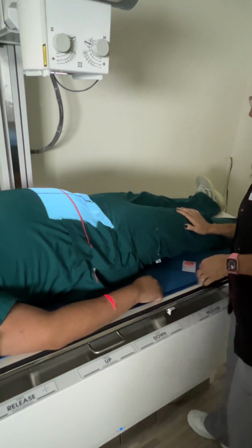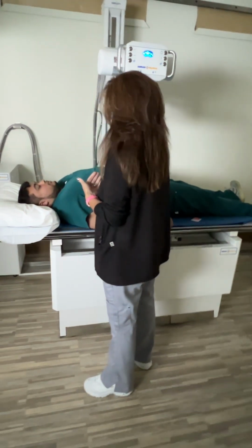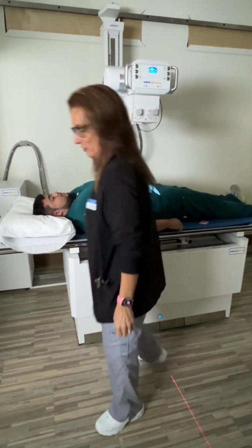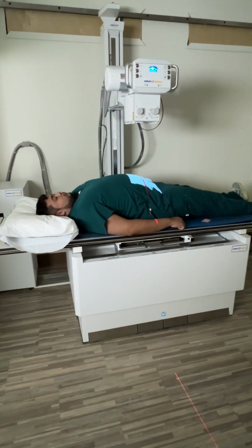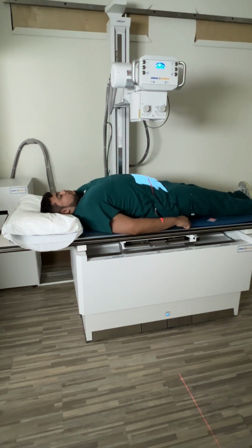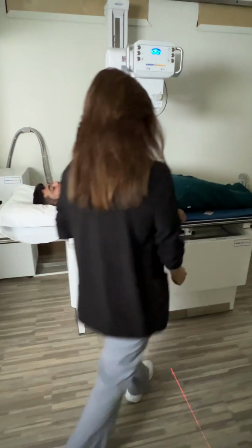So I'm gonna leave Andrew just like this, and I'm gonna tell him, when I have you, I'm gonna have you taking a deep breath, and then you'll blow it all out and hold it out, okay? Okay. All right, ready? Go ahead, take in a deep breath. Blow that breath all out. Hold it out, don't breathe. Beep. Good, you can breathe. I'm gonna leave it just like that.